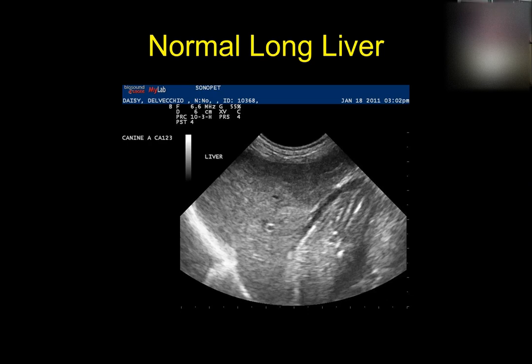So you have to make sure, as you fan through this with ultrasound, that you fan through the entire liver and you see every little nook and cranny and every margin of that liver. Okay. So right in here, there's part of the liver up in here that's cut off. And so you'd have to manipulate your probe and angle it up that way to see the edge of the liver. Make sure you see this part, because again, that could be out of the field of view. That could be where the pathology is.